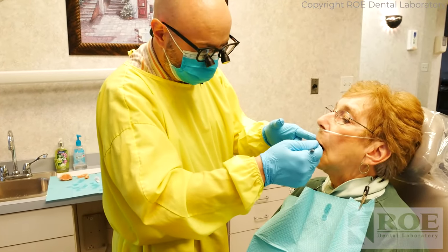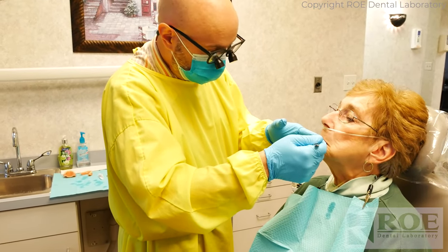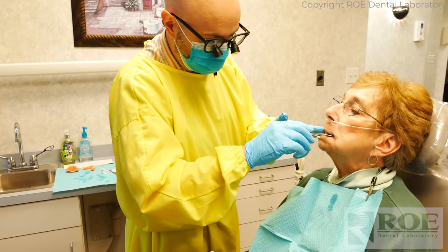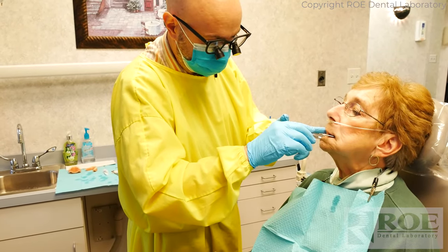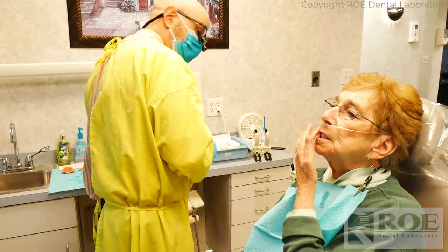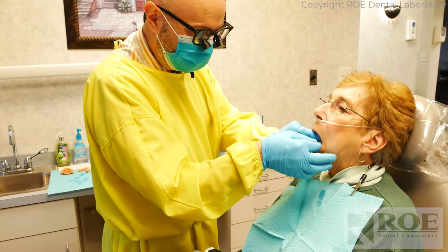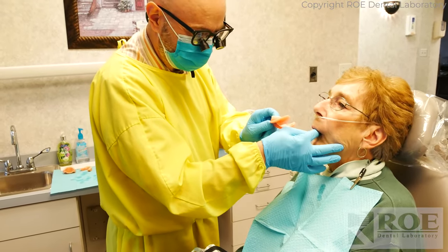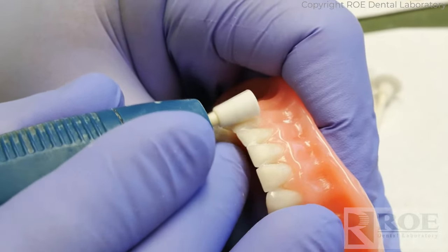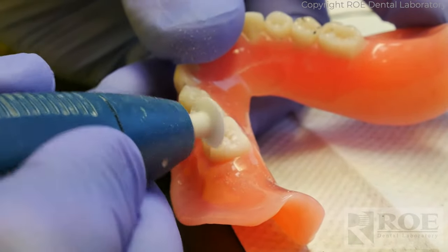Go ahead and bite down and grind left and right. Open again, thank you. Bite down again and go forward and backward. Not moving as much. Open again please, bite down, go forward and backward, and side to side. That's the first time it's touching that side — that's the first time you activated that right side. So that's why you felt more on the right side. The remaining polish is done with the polish — this just gets rid of the scratches.